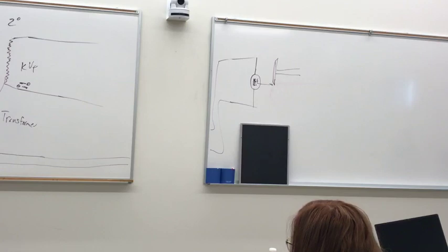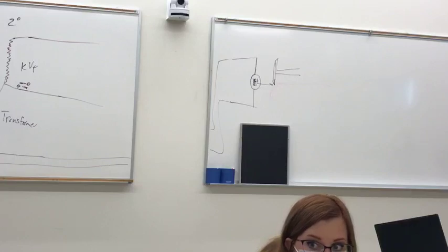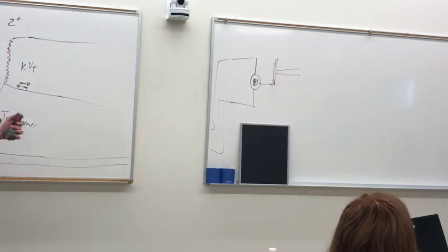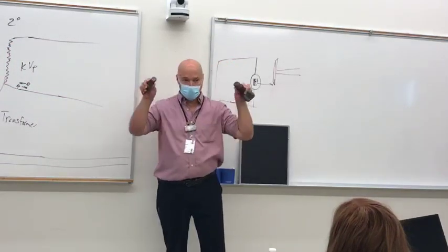Now, I'll pass this thing around, and this is not the best demonstrator of what I want you to see. This is the spinny part of the X-ray tube before they made spinny parts of the X-ray tube. This is too, okay? So this is probably primarily copper, but it's probably got a tungsten coating on it, and you'll see these.